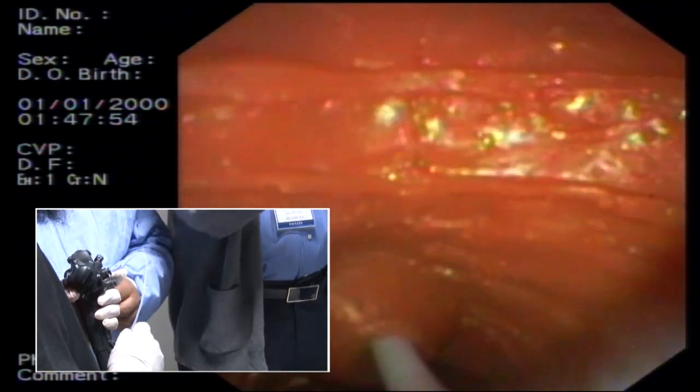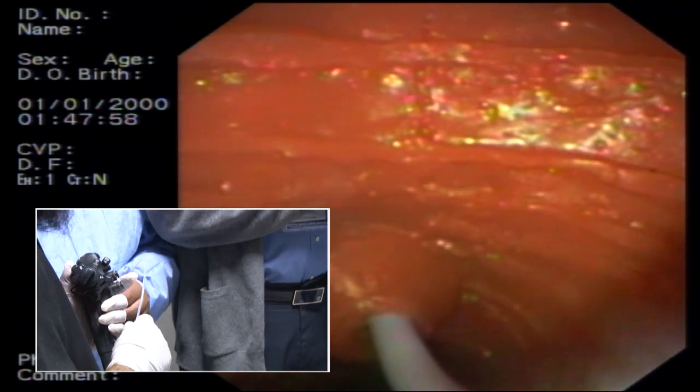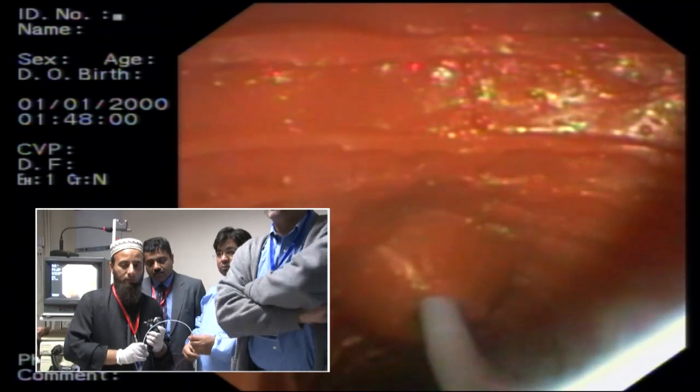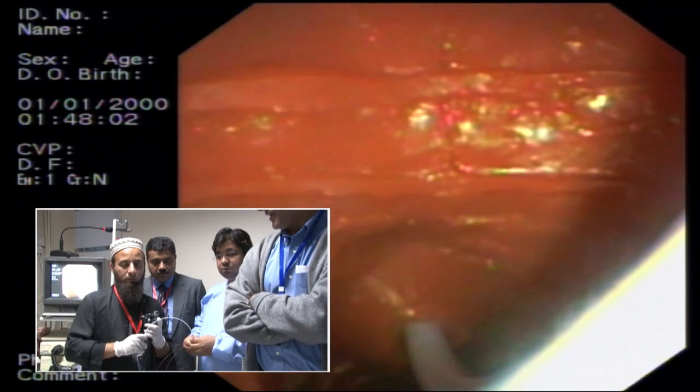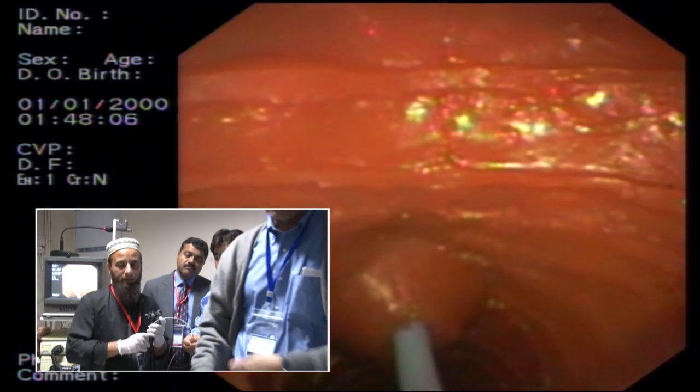Traditional teaching is that thoda sa phir elevator, phir thoda sa phir elevator. That's the traditional teaching, and that's fine. You know, you've got standard stenting. But I think 10 French stent puts a lot of pressure on the elevator. थोड़ा करीब करना है उसको.